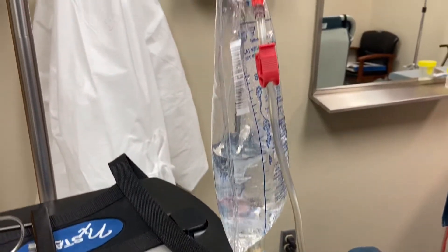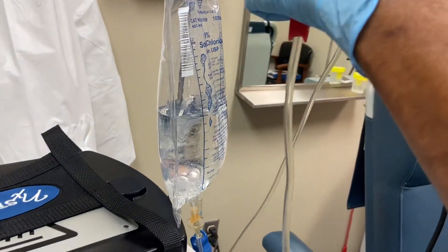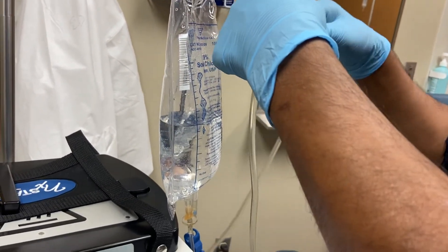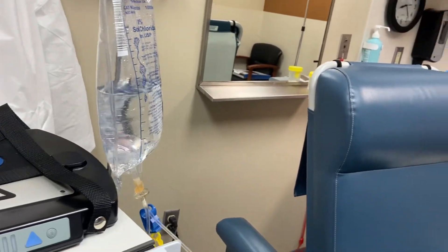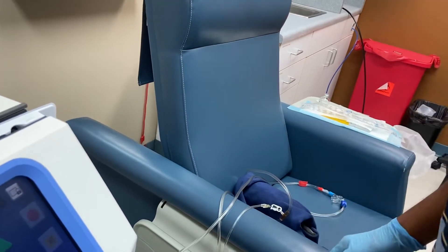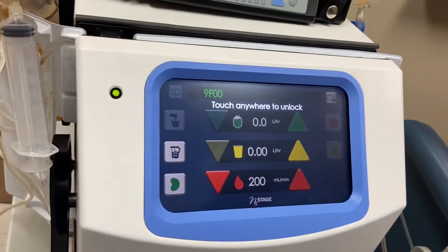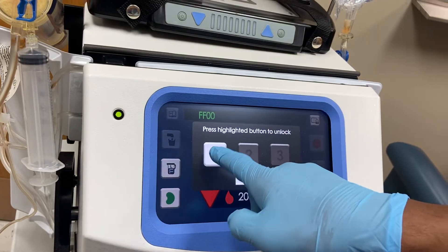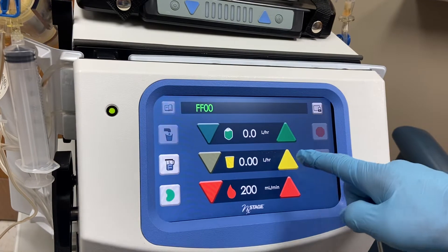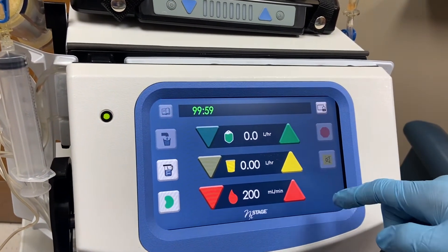Get your lines — those should be connected later on, not now. Get the yellow clamp and put it in place. Now let's enter the parameters. Start from yellow — that's your UF rate, or your removal per hour. Set it to the maximum: 0.55.